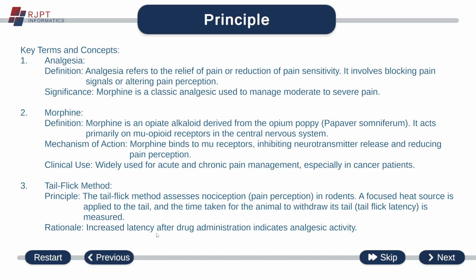Rationale: increased latency after drug administration indicates analgesic activity. So, whenever an analgesic drug is administered, the increased latency after that indicates the analgesic activity. The drug will increase the latency, meaning the time taken to withdraw the tail is increased.